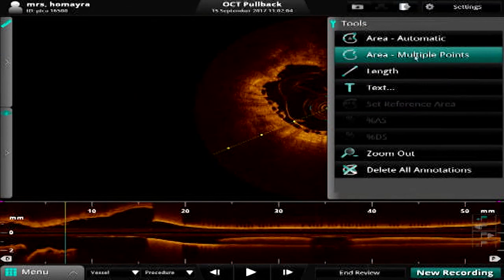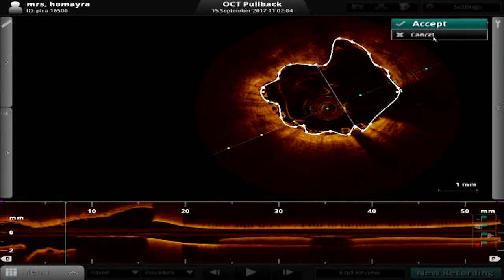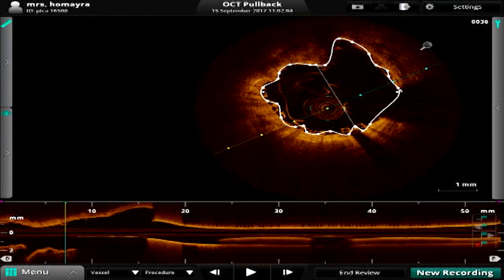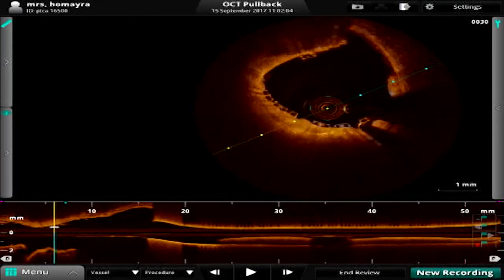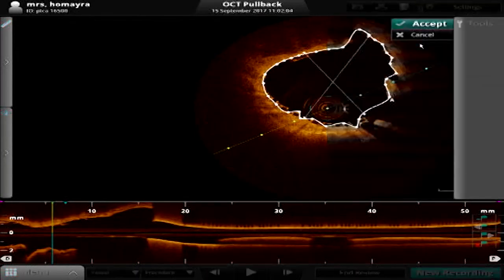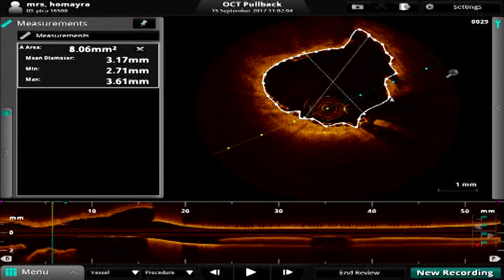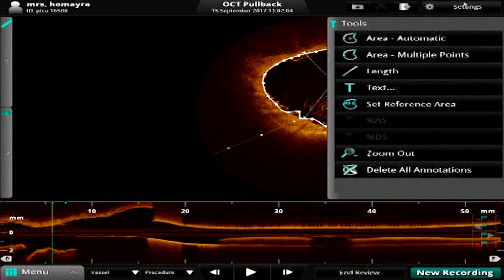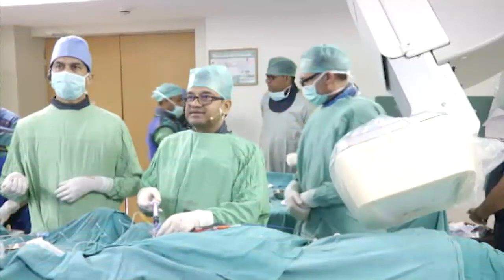Hold it. Can we get the caudal? Okay, we'll stay with you for another minute or two, and then we'll bid you goodbye. But I want to thank you and congratulate you, Dr. Kumar. Absolutely wonderful demonstration. If we can see the angio, that would be great.